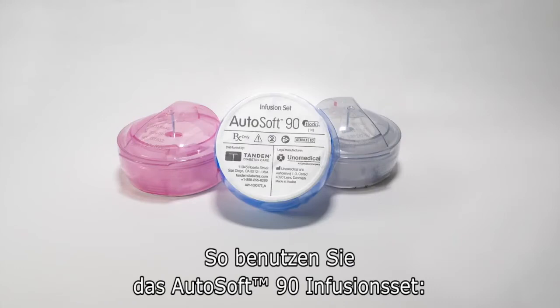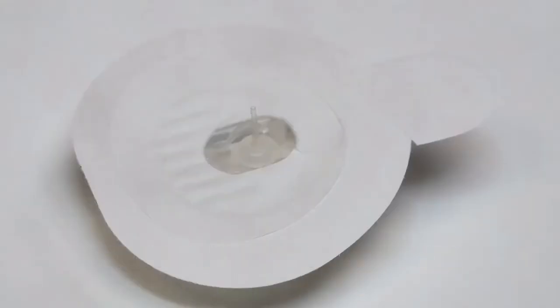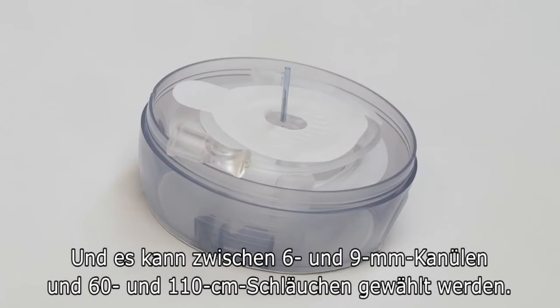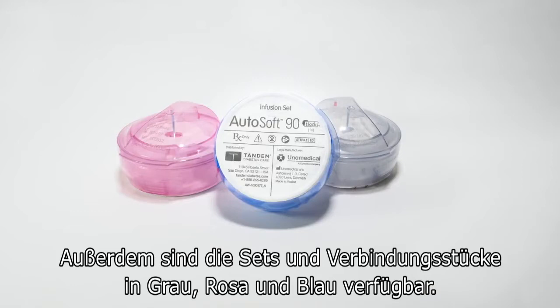How to use the AutoSoft 90 infusion set. The AutoSoft 90 is a very popular 90-degree set that uses a soft cannula and comes with an integrated insertion device. It's available with 6 and 9 millimeter cannulas and either 23 or 43 inch tubing. You can also choose between gray, pink, and blue infusion sets and connectors.